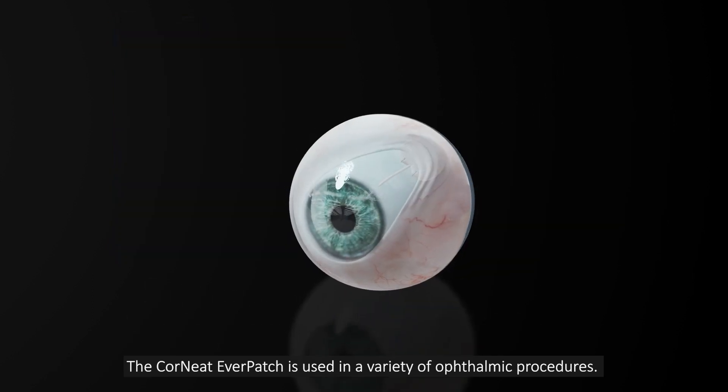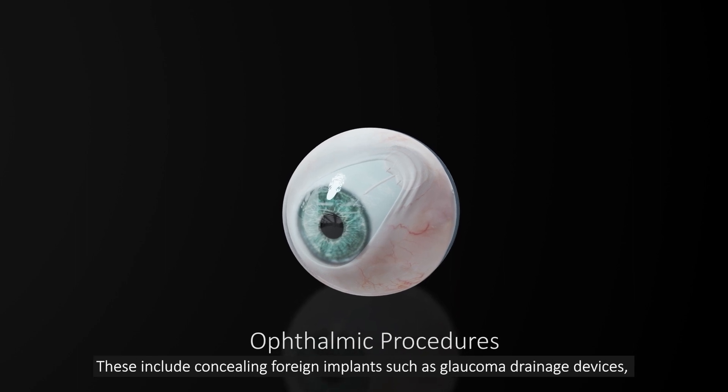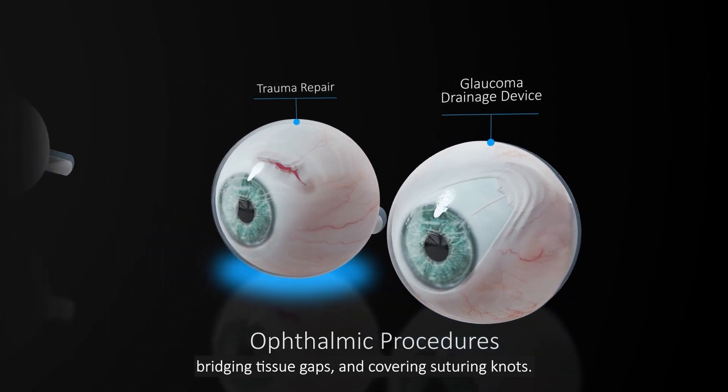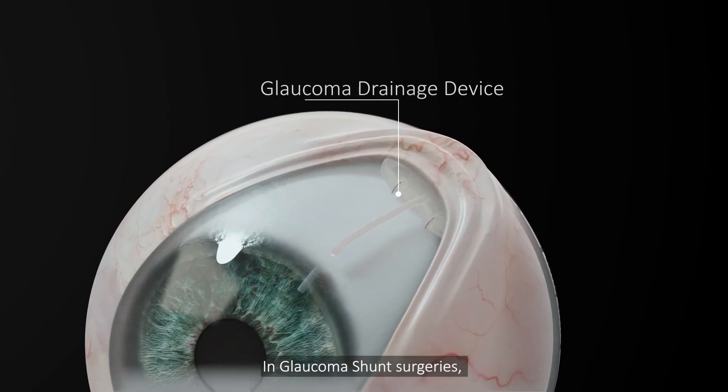The CorNeat EverPatch is used in a variety of ophthalmic procedures. These include concealing foreign implants such as glaucoma drainage devices, bridging tissue gaps, and covering suturing knots.